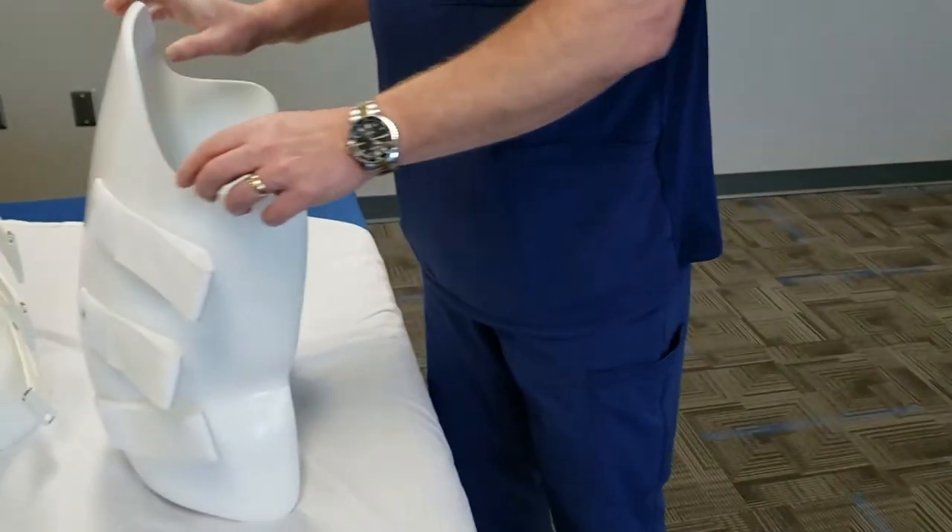As far as wear schedule for a brace like this, it's going to be put on when the patient gets out of bed and worn for the entire day, but they do not wear it to bed at night. A t-shirt or something underneath it would be more protective of the patient's skin than not having anything on underneath.